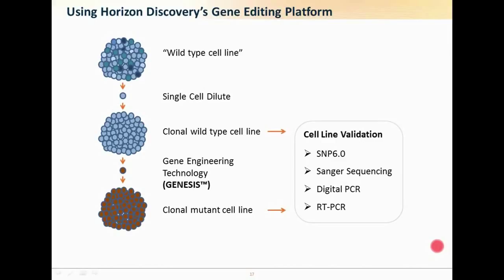We've made a big progress and developed a lot of reference standards, and I'm going to show them in the next couple of slides for molecular assays. Over the last 9 to 12 months, we've started to move more into the IHC and the FISH world, as it were, and we have some good ideas.